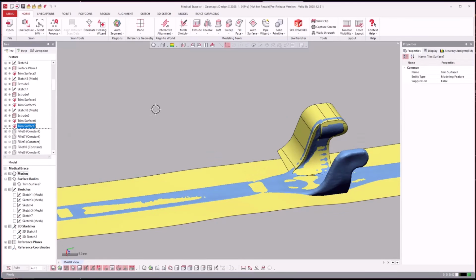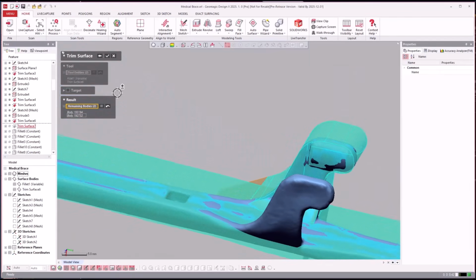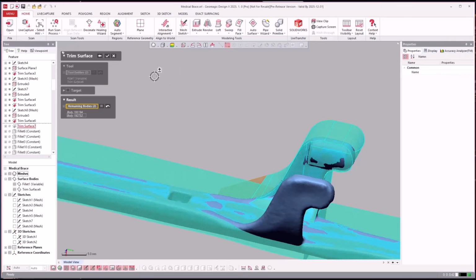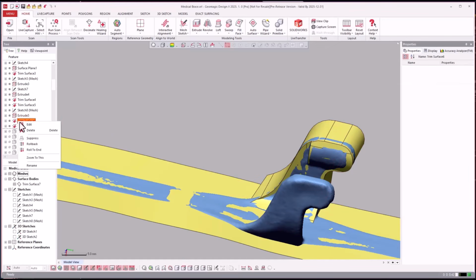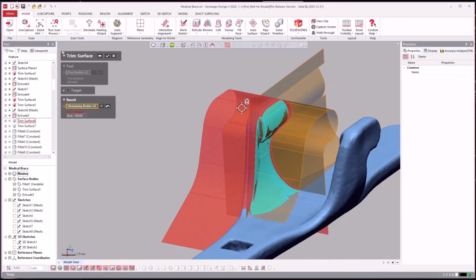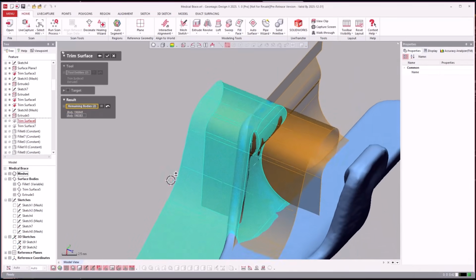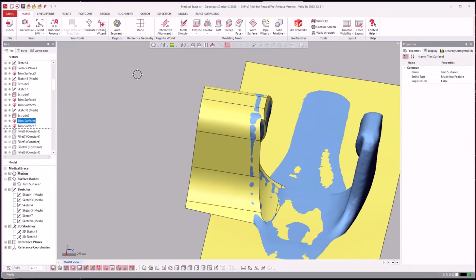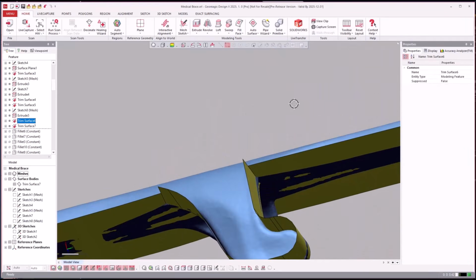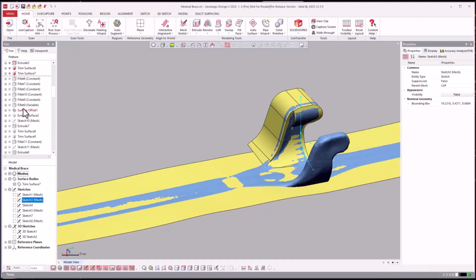Now, let's just open that one, just because a lot happened all at once there. And let's open up the first one. Let's open up this one. So they extruded this through and then trimmed it with the surrounding surface. And then trim that in with this too. Lots of trimming. And then we go back and add our fillets.